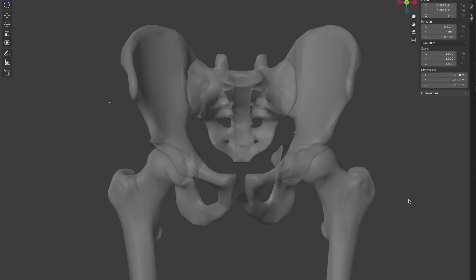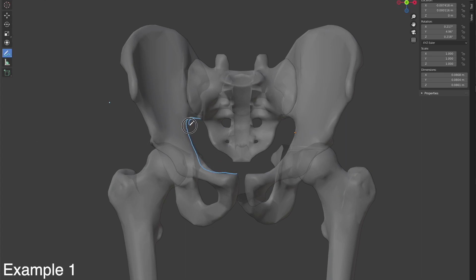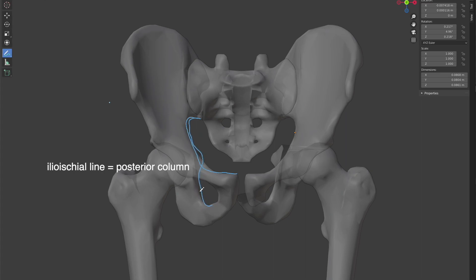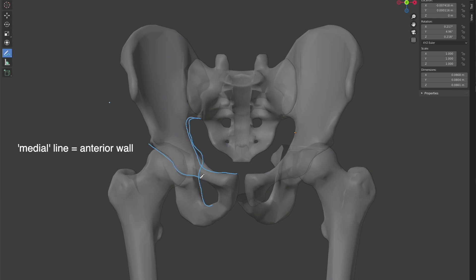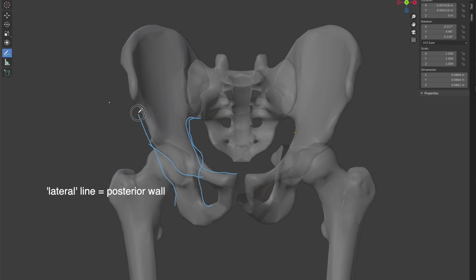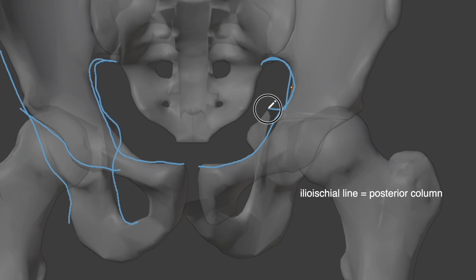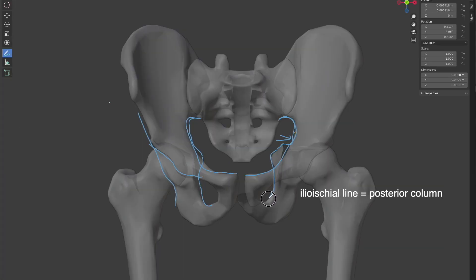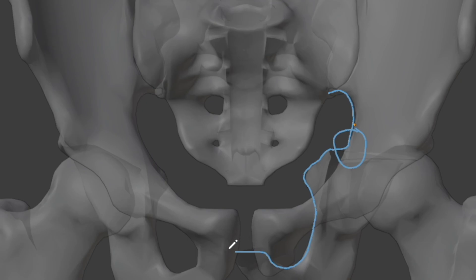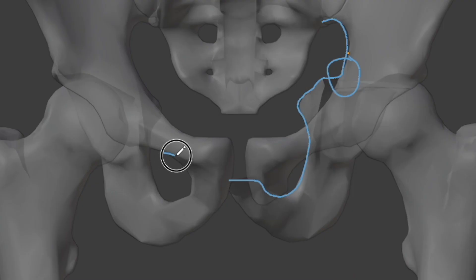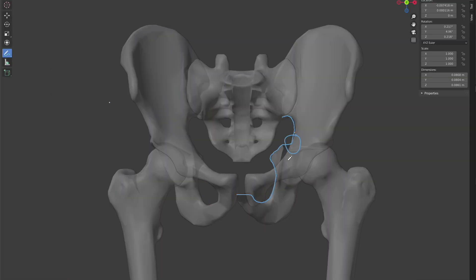Let's go through some examples. Starting with the AP view on the right side: the iliopectineal line is smooth, the ilioischial line is smooth, the anterior wall is smooth, and the posterior wall is smooth. On the left side: the iliopectineal line is smooth, however the ilioischial line shows a sudden sharp change in angle. Going further down, there is also a lack of continuity of the lower part with the pubic bone — unlike the right side's smooth U-turn — which suggests a fracture of the posterior column.